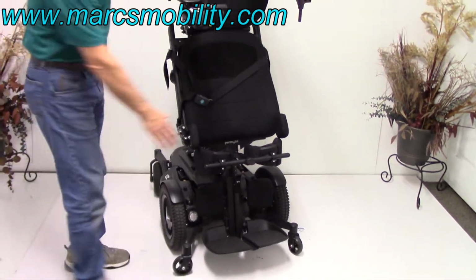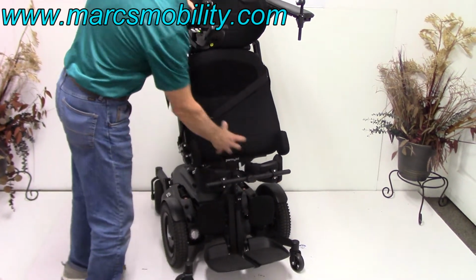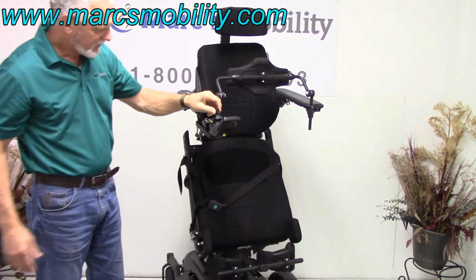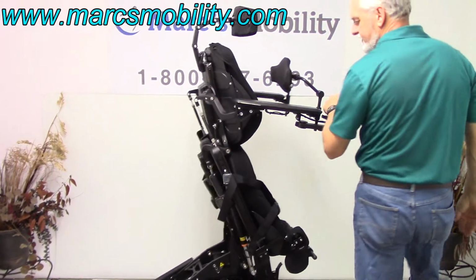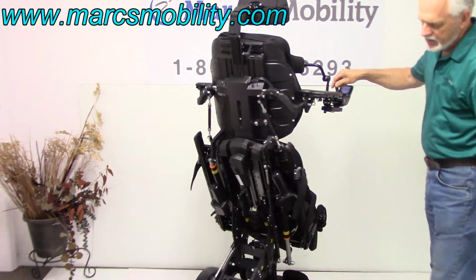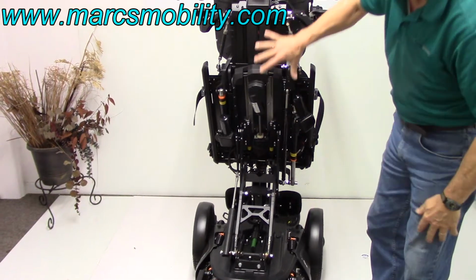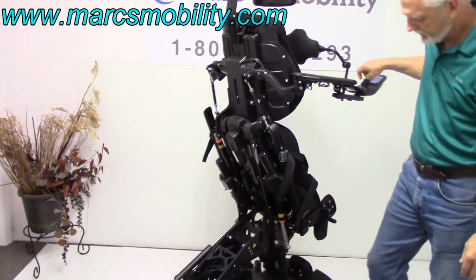You can see where your knees will be locked in here. This knee brace can be adjusted. The chest guard can be adjusted in each position you want. So this is your standing feature. I'm going to turn the chair around so you can see the back of it. This is the back of the power chair. You can see your armature here for your standing feature. Everything is here. I'm going to bring it back this way.